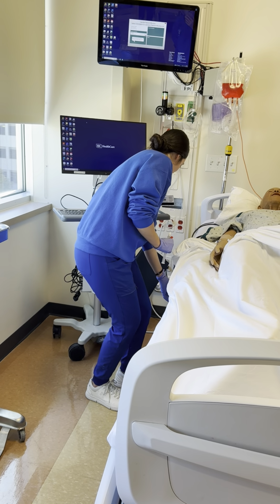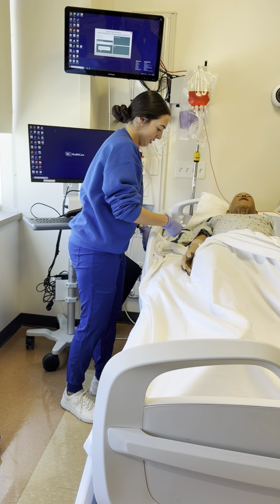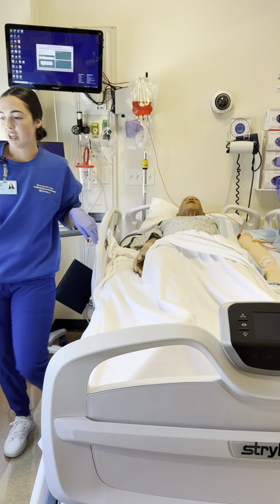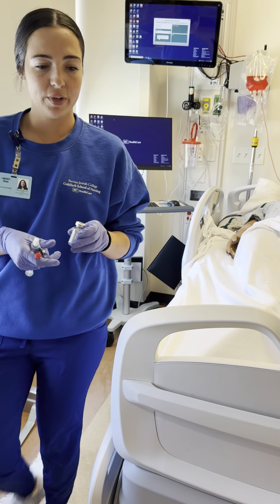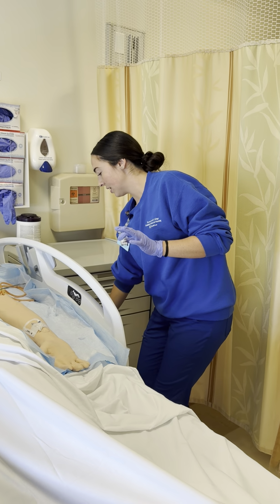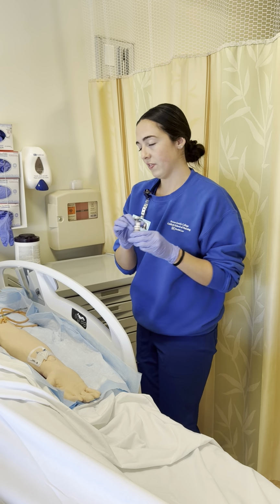And I'm going to make sure I lock the bedside. I'm going to go ahead and grab my supplies. I'm going to go to the other side here. I'm going to throw away everything that I'm now finished with, making sure to hold on to this vial.